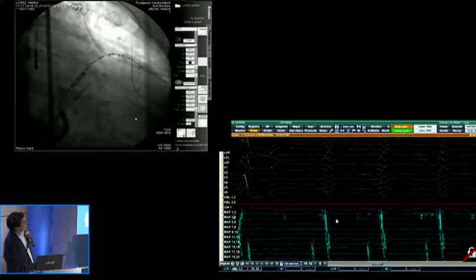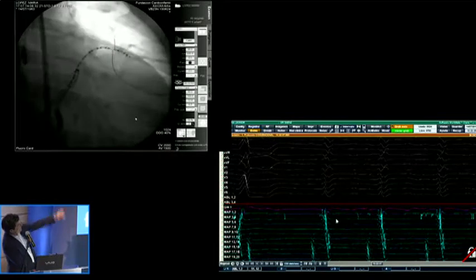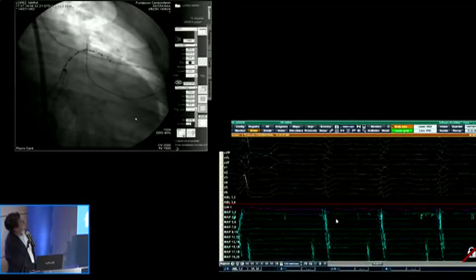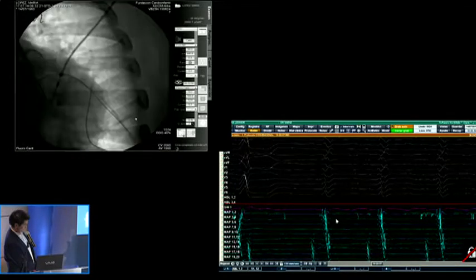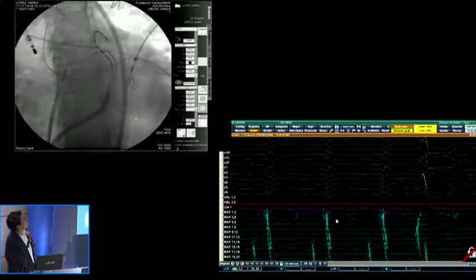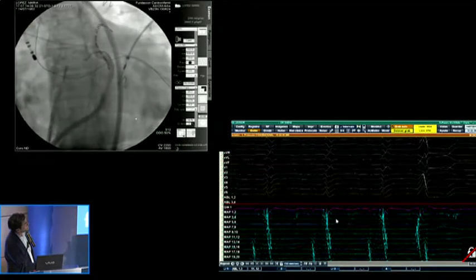Well, you only obey when I complain before the audience. Well, this is fascinating. In the right atrium, we don't see what is happening. The wire in the left atrium, we can see that it is moving towards the right side. Anatomically, it's fantastic. This image is fantastic.